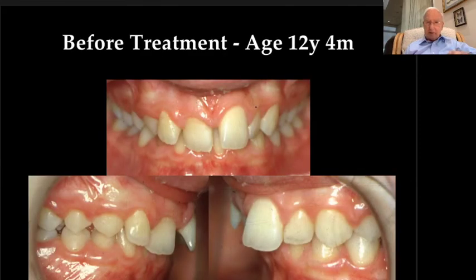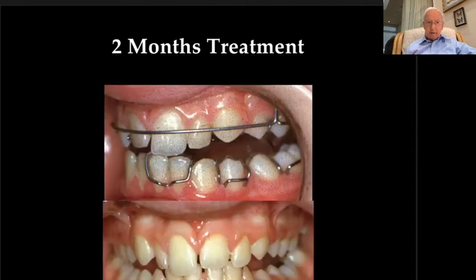One upper incisor is trapped inside the lower lip, while the other central incisor is proclined outside the lip. The mandible is trapped in distal occlusion by the single retroclined central incisor. This type of malocclusion responds very quickly when the retroclined incisor is advanced with a lingual spring. The mandible advances to unlock the malocclusion within 2 months of starting treatment.